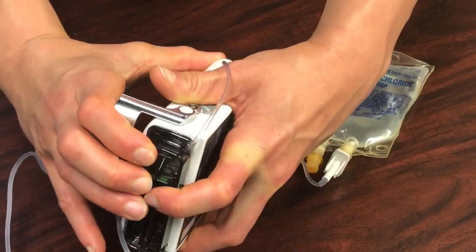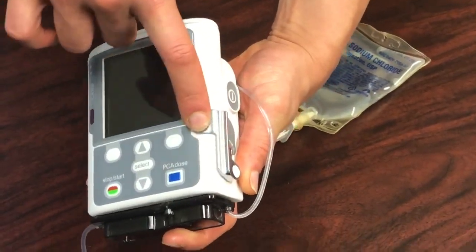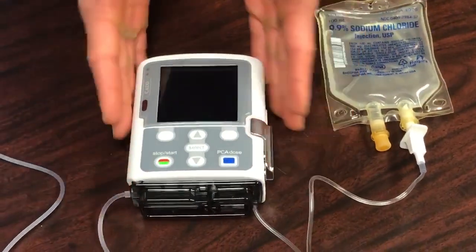Press down, then bring the lever back up just like that. And that is how you attach the cassette tubing to the pump.